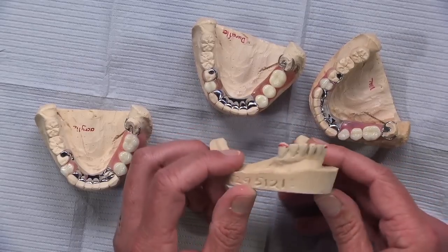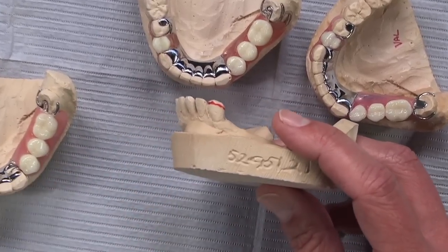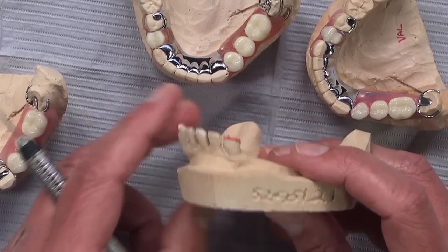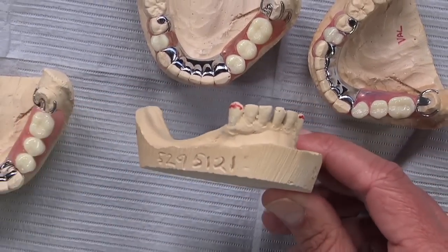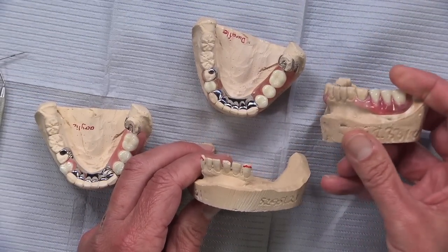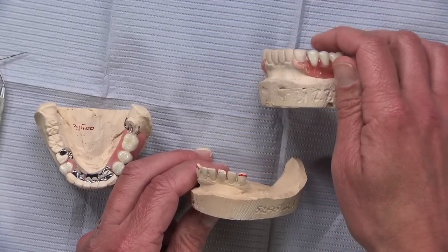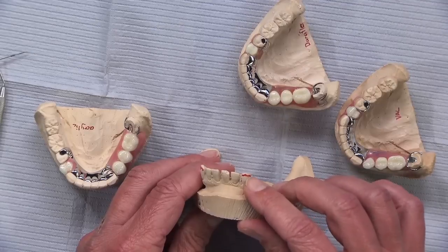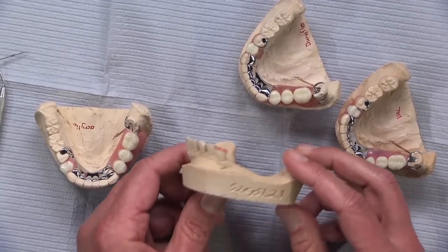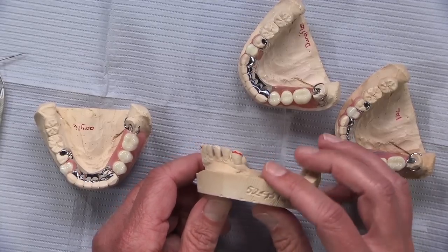You can see a bilateral free end, and you can see that the technician has already marked with the surveyor to show where the height of contour is. And so this is a good example of a case where, whether it be a Valplast clasp such as that one or a Duraflex clasp such as this one, it would have to cover the entire tooth in order to engage that undercut, because it's not as strong as a metal clasp would be.